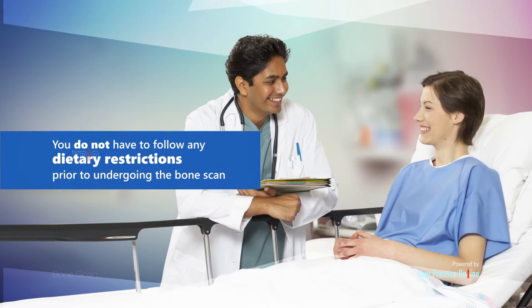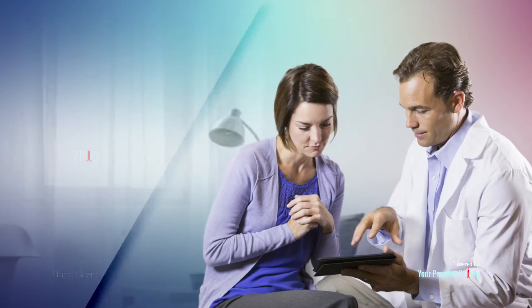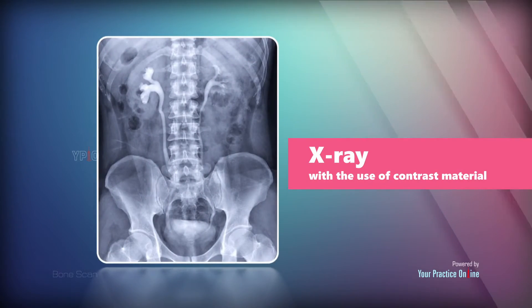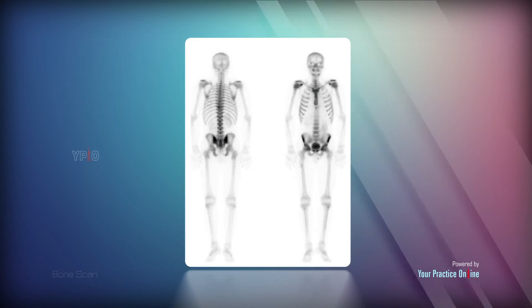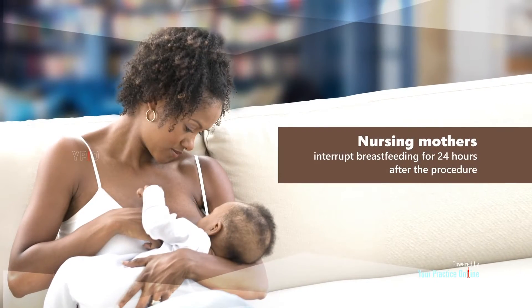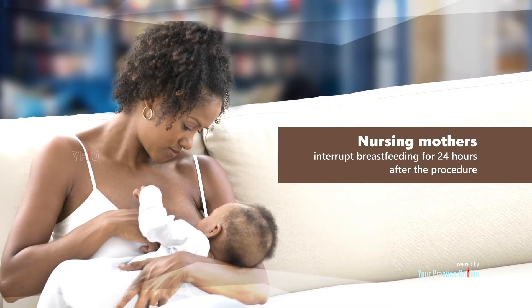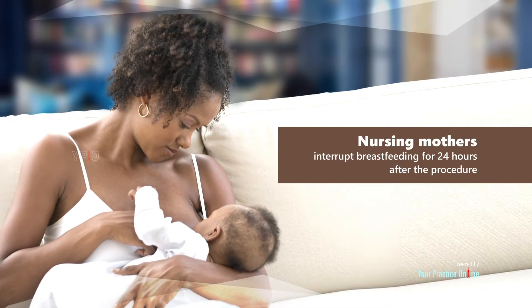You do not have to follow any dietary restrictions prior to undergoing the bone scan. However, you should inform your doctor if you have taken any medication containing bismuth, or have undergone an x-ray with the use of contrast material, as this may interfere with the results. Also inform your doctor if you are allergic to medications, contrast dyes, or iodine. Nursing mothers should feed their baby right before the procedure, then interrupt breastfeeding for 24 hours, pumping and discarding the milk produced during that period.